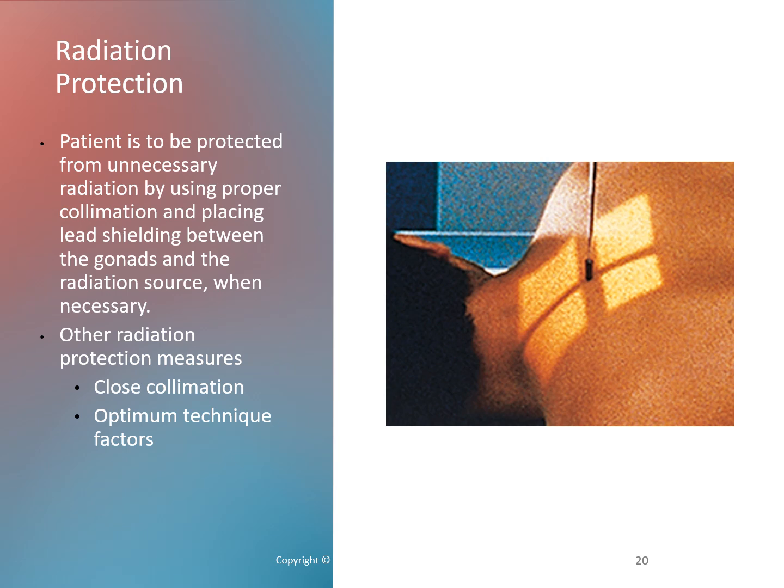So here you see the 4x4 collimation for the sternoclavicular joint. If they're ordering a sternoclavicular joint, that's to be in the center of the image, and they only need a 4x4 square. If the doctor wants an entire clavicle, he can order a clavicle series. That's a different evaluation than a sternoclavicular joint. Okay?